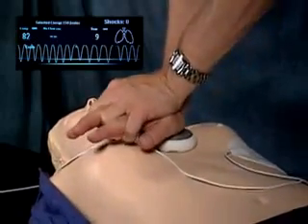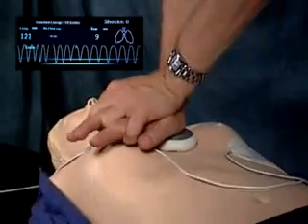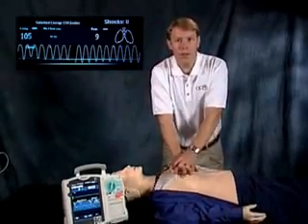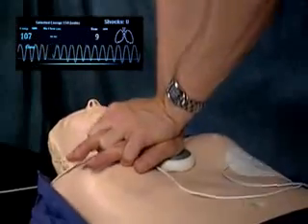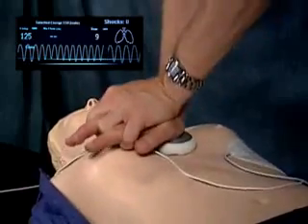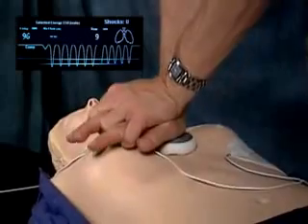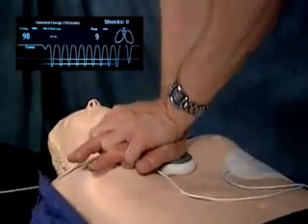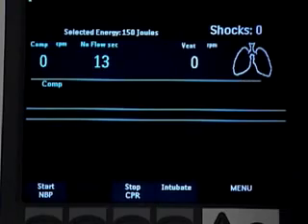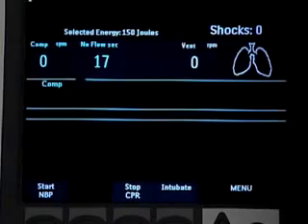Now I'm not going fast enough. Compress a little faster. At this point, my compressions are not deep enough. Compress deeper. Now I'm going too fast. Compress slower. At this point, I'm compressing too deep. Don't compress so deep. If I haven't done a compression for 15 seconds, it will prompt me to start again. 15 seconds without compressions.